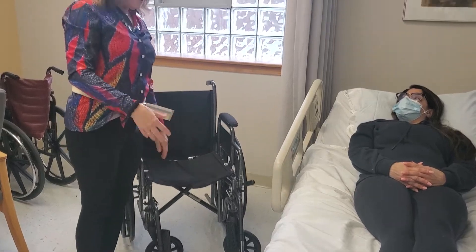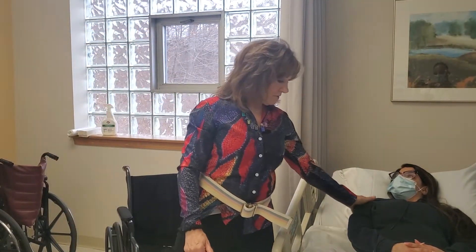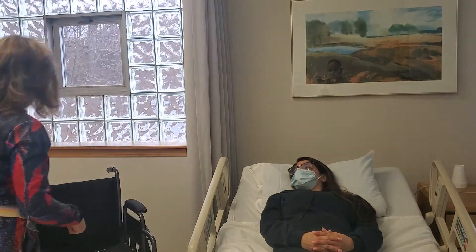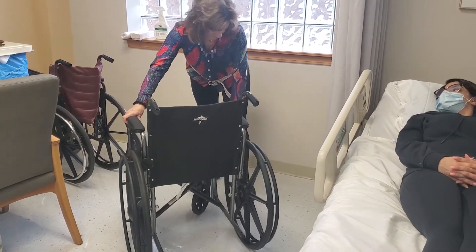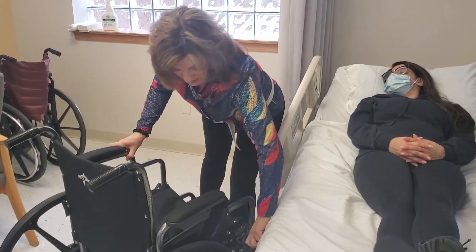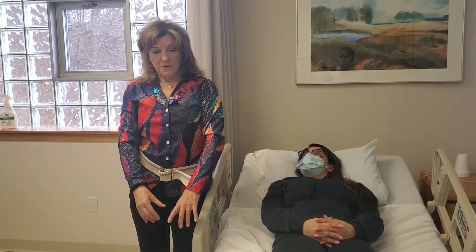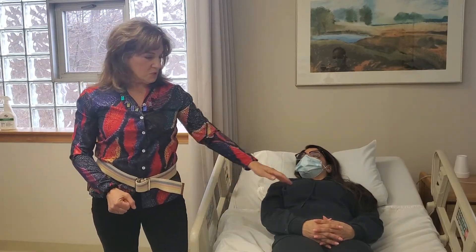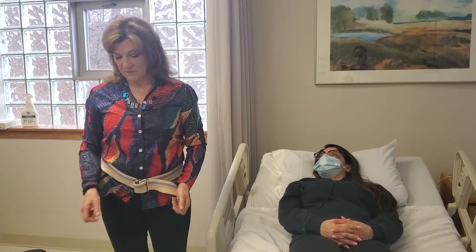I'm going to put the leg rests up because when we get somebody out of bed, their feet are going to touch the floor first, and then you put them on the pedals. Now Cassandra has a weak side on her right side and her left side is her strong side. You want to position the wheelchair so that she can feel successful helping you. We're going to angle it at 45 degrees. The reason for this: if her strong side is here and you're getting her to sit up, you want her to be able to reach over to the seat to stand up. If her weak side were toward the chair, she'd have difficulty and it wouldn't be successful — and you'd probably hurt yourself as a caregiver too.